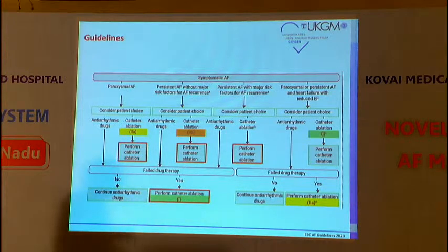And what about patients with heart failure? I think this is also in India a huge problem. Patients with heart failure. Look into the guidelines. They say antiarrhythmic drugs or a class 1 indication for catheter ablation. In these patients, we had the CASTLE-AF trial, which was published in the New England Journal of Medicine 3 years ago.